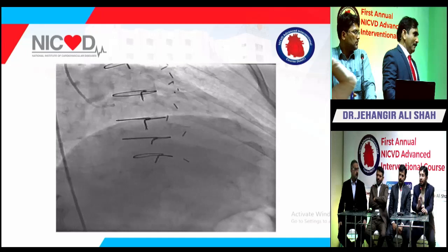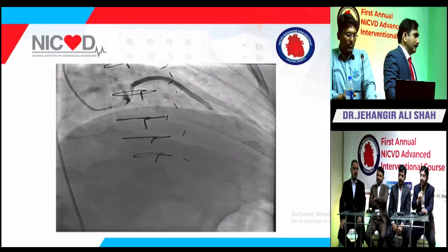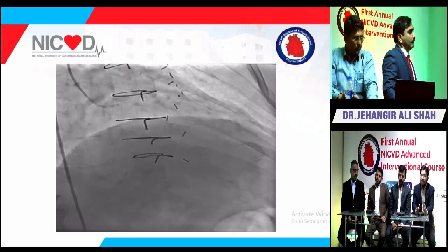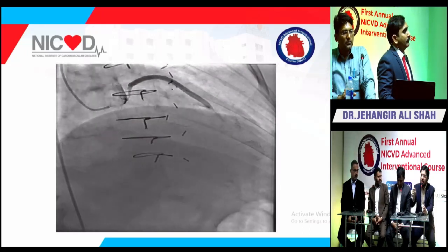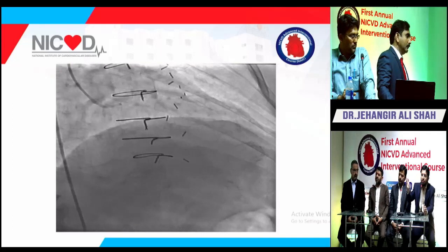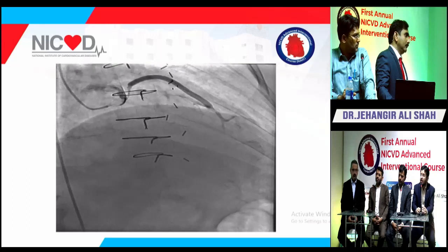Yes, this is a very critical patient, and this LAD is the lifeline of the patient. As Dr. Bashir said, attempting antegrade intervention into the LAD is very dangerous, even with dual injection if you give from the SVG.